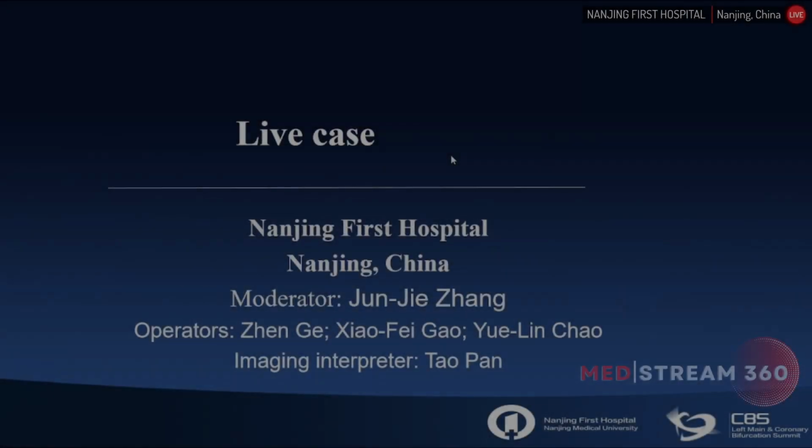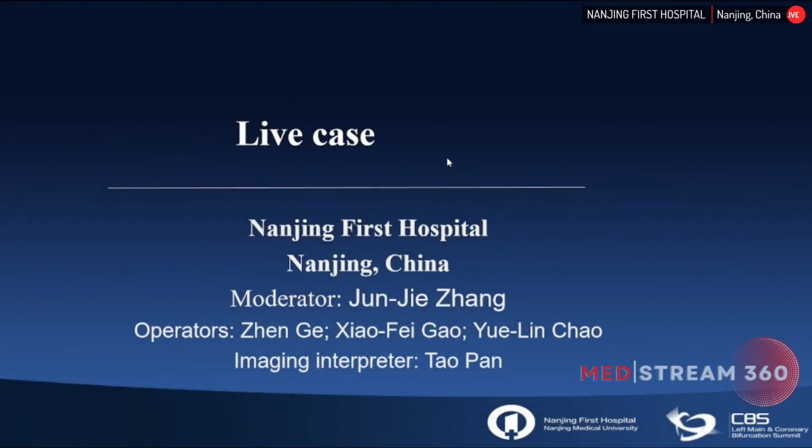First, let me introduce my team. I'm Dr. Junjie Zhang, and today the live case operator is Dr. Ge Zhen. So please, Dr. Ge, introduce your team. On my right is Dr. Gao and Dr. Chao, and our nurses, and the technician is Dr. Pan. So firstly, I want to ask Dr. Gao to introduce the patient clinical information.